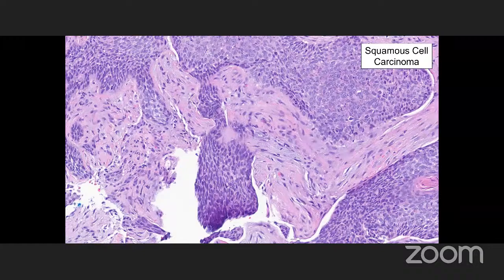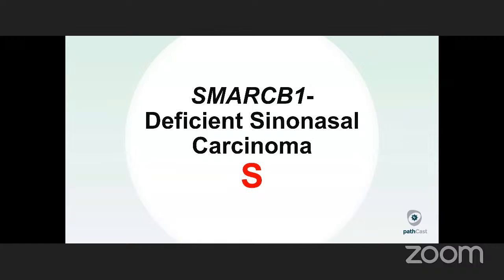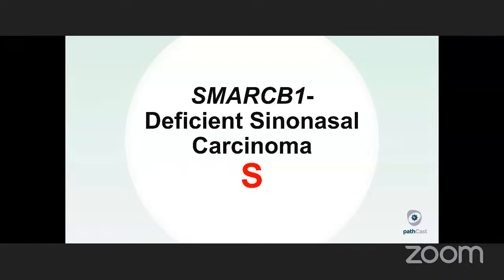Usually has a lot of apoptosis, mitosis. And then finally, if you get a little bit of spindling or fusiform growth where they get kind of pointy like this, that's pretty good for squamous cell. And of course, a little bit of abortive early squamous differentiation there. So those are pretty much clues that you can recognize that even if it really doesn't show any maturing squamous differentiation, large nests, a little bit of spindling, high mitotic activity, and lack of desmoplastic stroma are all very good clues for that.